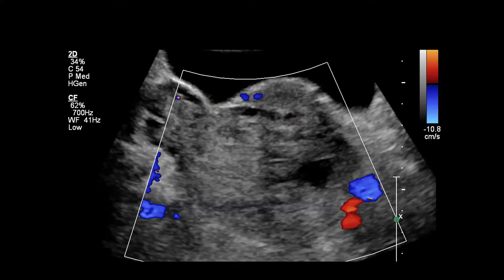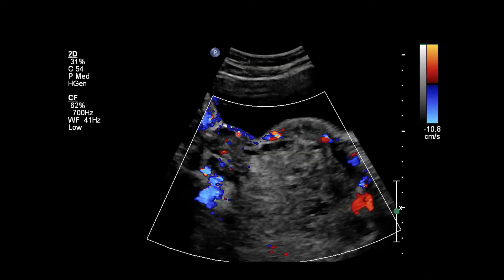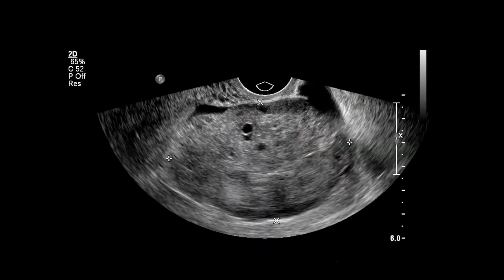Just this heterogeneous amorphous echotexture. Comparing to the right ovary, notice how we do have internal flow within the right ovary, but nothing within that left ovary. So that's a good comparison image.